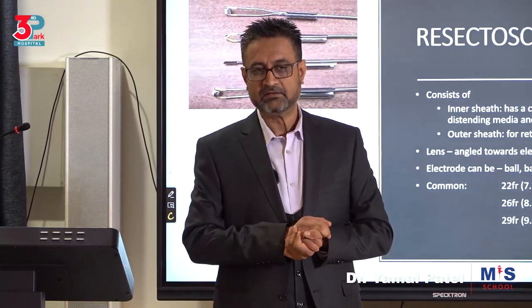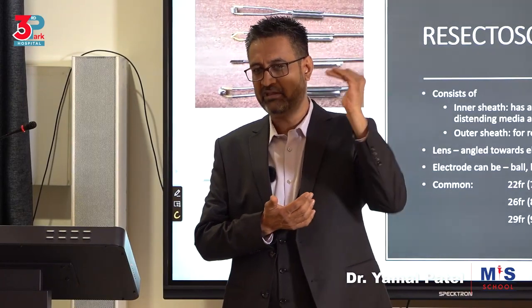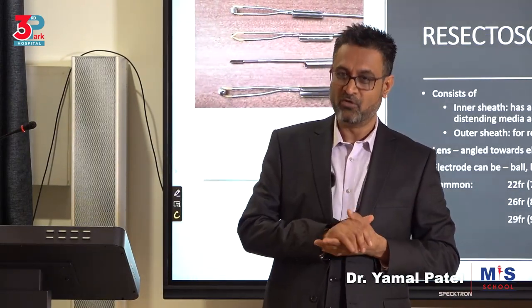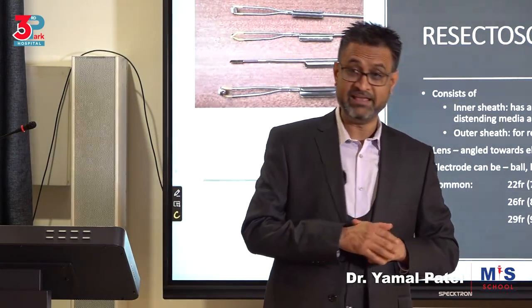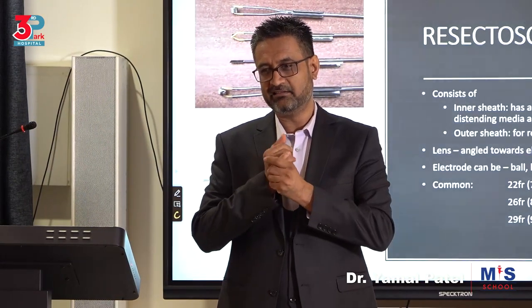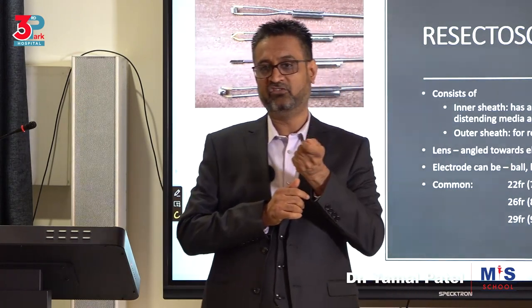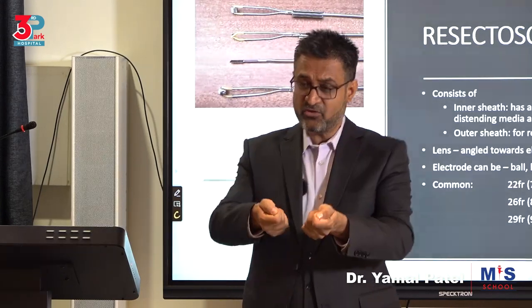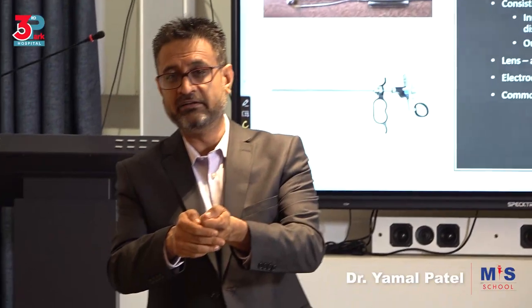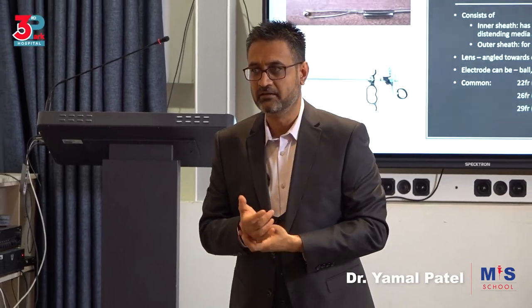In the past, we used to use monopolar resection with non-electrolytic solutions, which could be either hypotonic, hypertonic, or isotonic, but non-electrolytic, because monopolar cannot work in electrolytic solutions. And nowadays, we use bipolar. So my question many times to the students is, if I'm doing hysteroscopy, we use saline, am I right? So, a question. If I'm using saline and I use a monopolar resectoscope and I activate it by mistake inside the uterus of the patient, what will happen?